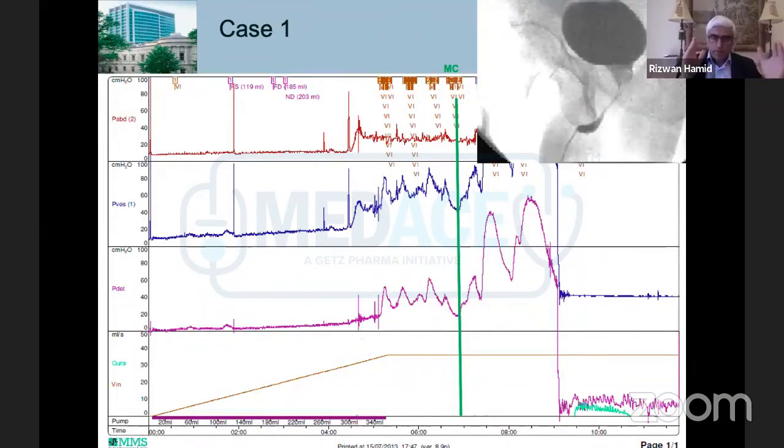He's complaining of frequency urgency. We have outlined, he's got classical overactivity, very high pressure overactivity, probably leakage. And then with this overactivity, a voiding command was given, poor flow, and you can see on the accompanying video that he's got a post-TURP stricture. So now we've got a good diagnosis.